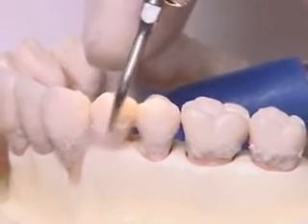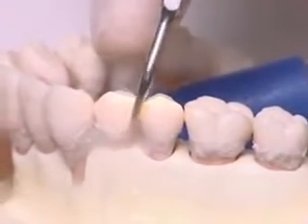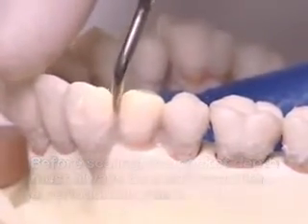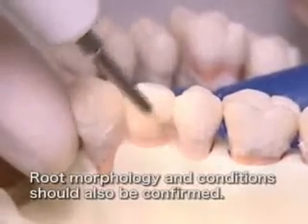Calculus and dental biofilm will be removed simultaneously. Before scaling, the pocket depths must always be measured with a periodontal probe. Root morphology and conditions should also be confirmed.